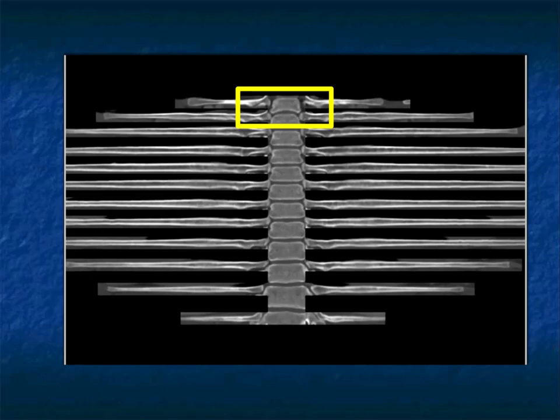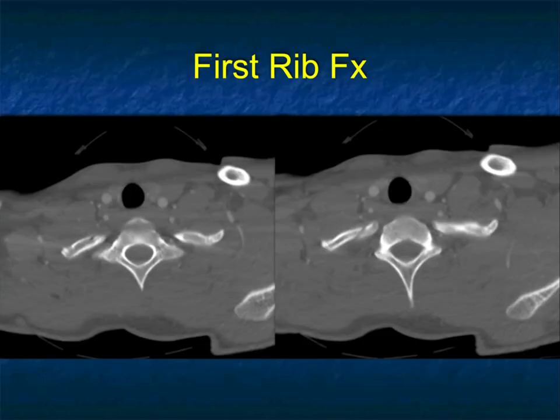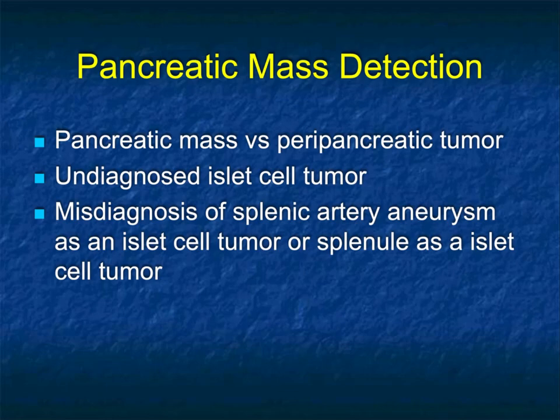So it takes you just a few seconds, but it saves you time. So it's important we do this routinely on all trauma cases. I wonder if we should do it almost in all cases, particularly oncology patients, where you might be looking for rib fractures, and subtle rib fractures or subtle rib lesions perhaps can easily be missed.